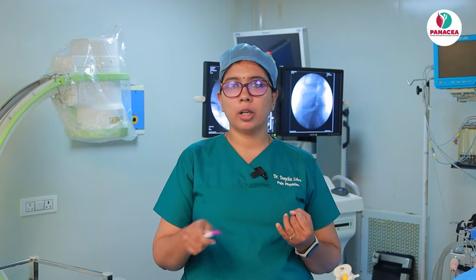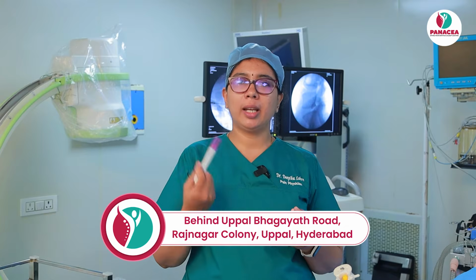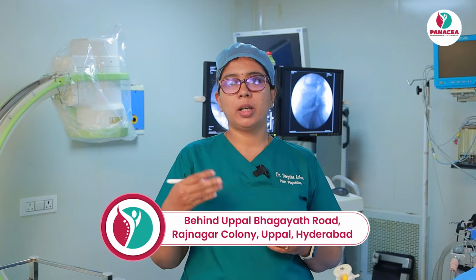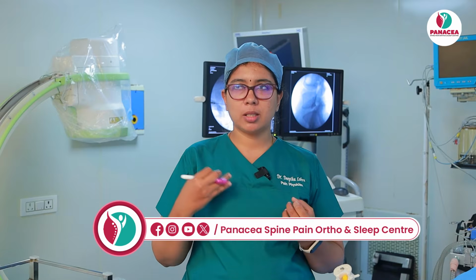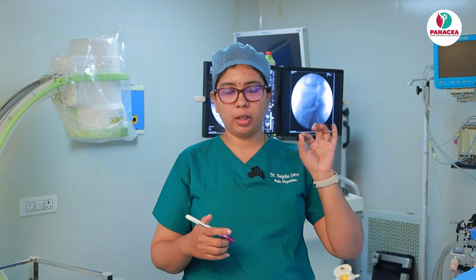Always make sure that you are not intravascular. Always aspirate and see before giving anything. Even if you are giving the drug, or before that giving dye, whatever is being injected, before injecting, aspirate and see if there is some CSF coming or some blood coming. Redirect the needle, or even if you are not sure, you can abandon the procedure, but never go ahead with giving the drug if you are not sure that you are in the right place and your needle is in the right position. So before starting the procedure, let me just get you familiar with all the drugs that we are going to use for the procedure.